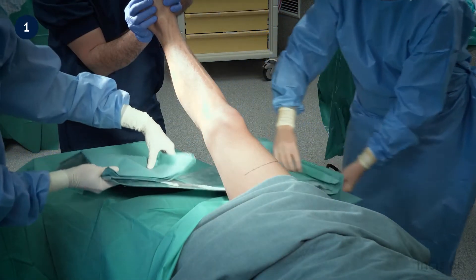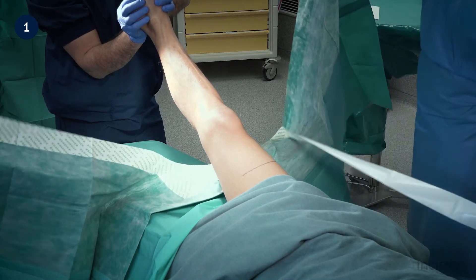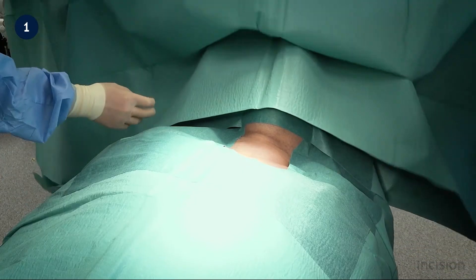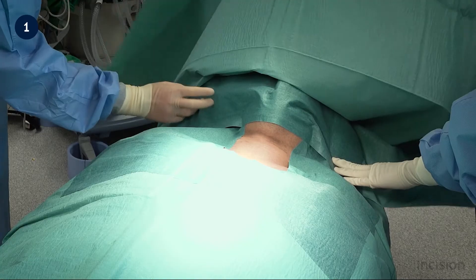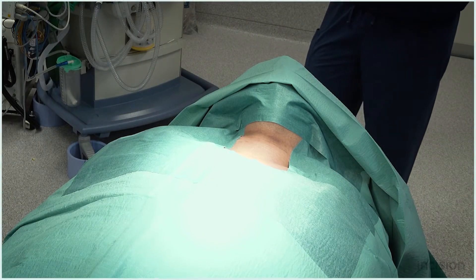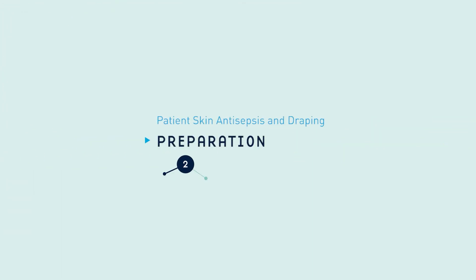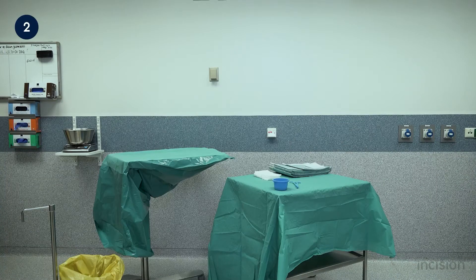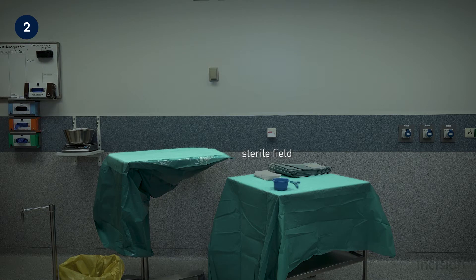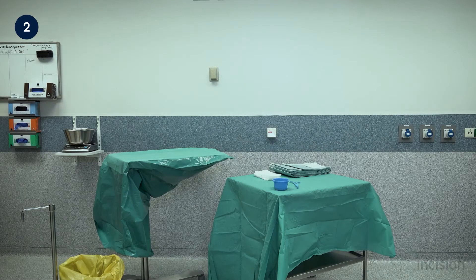Surgical draping techniques and types vary widely between hospitals and procedures. The objective, however, is always the same: to build a sterile field upon which surgery can safely be performed. In this film, disposable adhesive drapes will be used to show a number of techniques. Patient skin antisepsis and draping requires a sterile field. For a more detailed elaboration of how the field is set up, refer to the course Table Setting, Basic Instruments and Disposables.